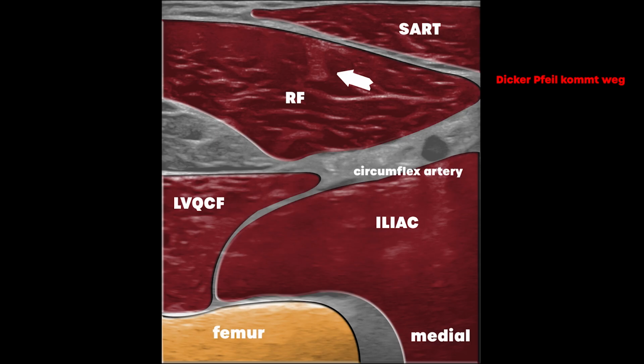The tendon is then followed even further distally until the muscle belly becomes fully visible.